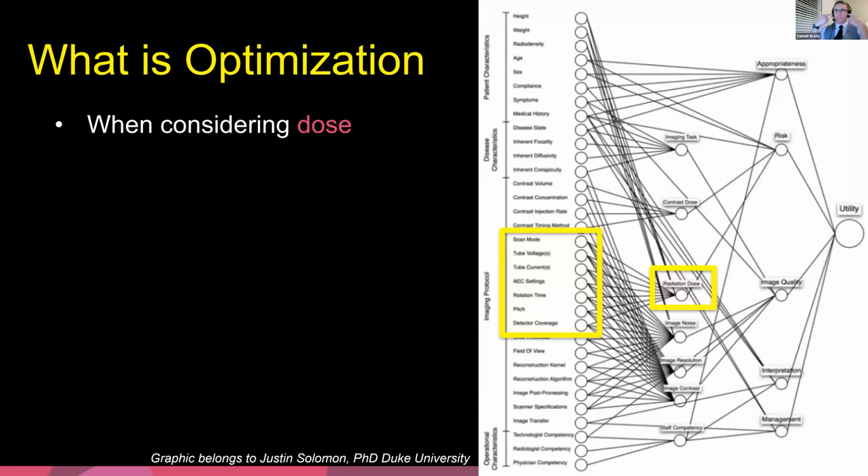Orbits, soft tissue for the face. You need to have the right noise content, but that's kind of the same as the brain. You just optimize the right mA. Obviously, there's still bone in the face, but not as much as we don't have the cranium. And obviously, if you're doing sinuses, it's mostly air filled. It's an air filled cavity that could potentially be filled with infection.